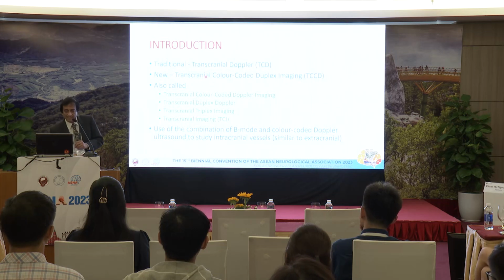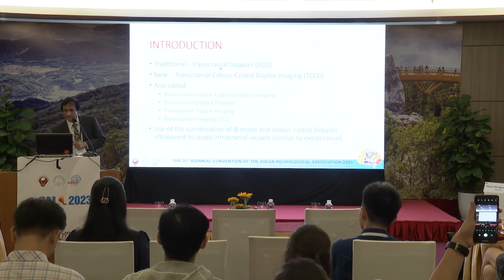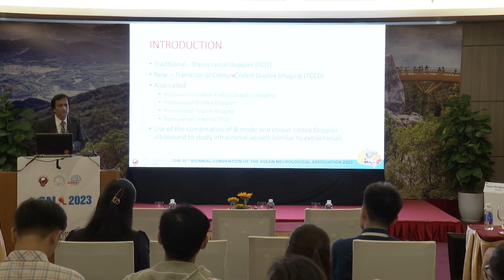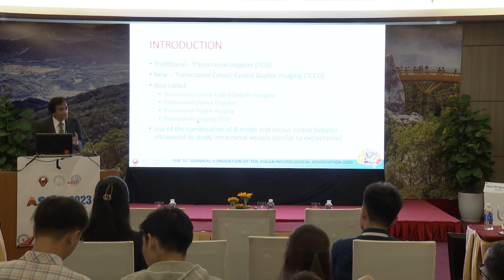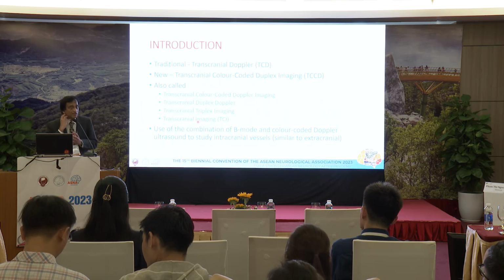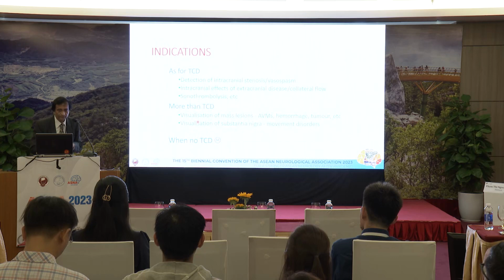Traditionally, TCD has been used for many, many years to study the brain arteries. You'll have a lecture on this a little later. The new technique I'm going to tell you about is called TCCD, with many other names to describe the same technique. What it does is combine B-mode imaging of the vessel, as well as blood flow, together with blood flow only, and bring it all together under one heading.